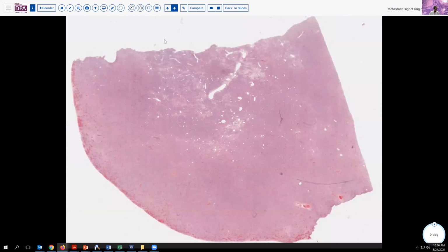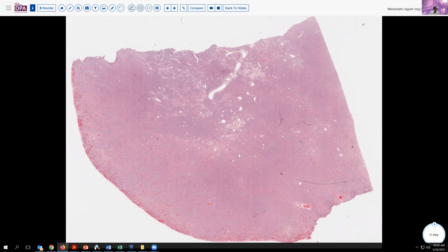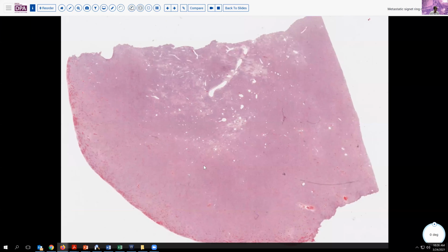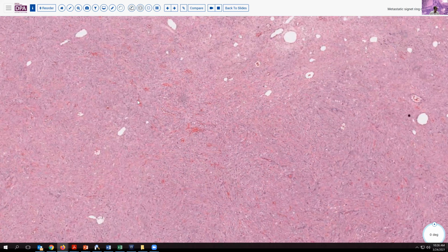Now, this is another example of a gastric cancer metastatic to the ovary. But this is a nice example of how a very diffuse pattern can appear in these lesions. At low magnification, we see a few dilated vessels, but a very solid appearing neoplasm. And even as we come into higher magnification, we see that there's really a lot of stromal appearance. So if you just did a low power and maybe intermediate power pattern, you might be tempted to say, oh, fibroma, fibrothecoma type of lesion.